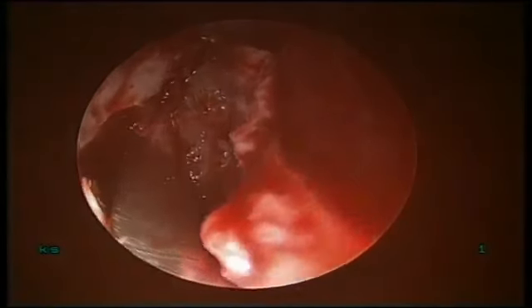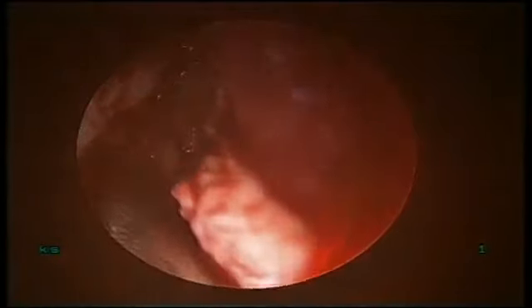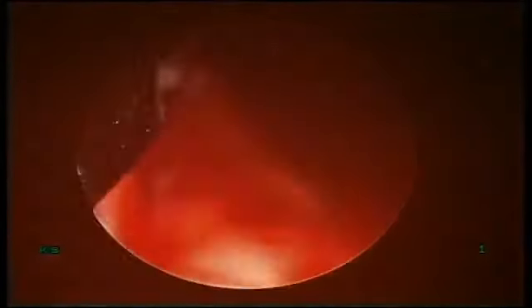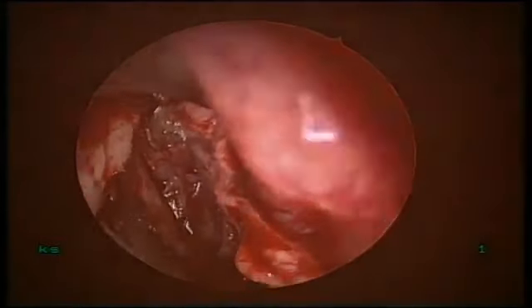Yeah, very rarely, particularly in males and with good build, either be patient and remove slowly or use the powered instrument. You can use the drill from the Medtronic micro debrider.